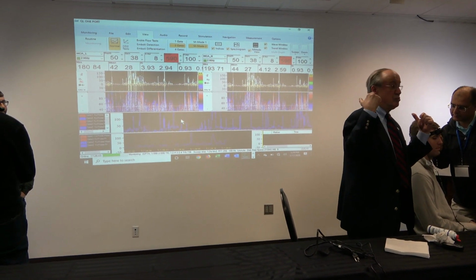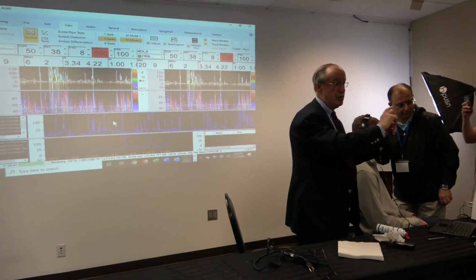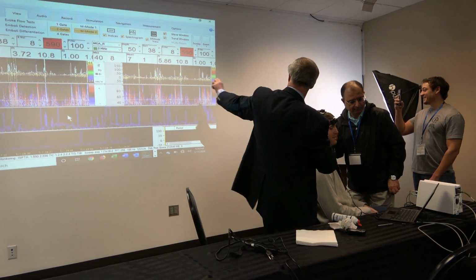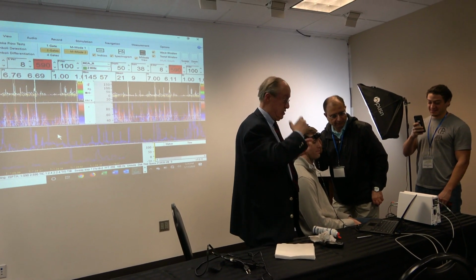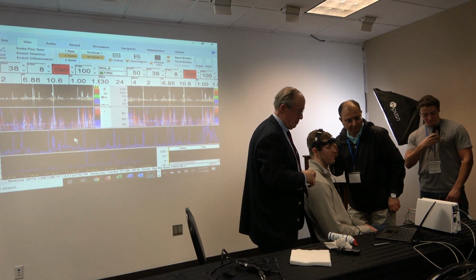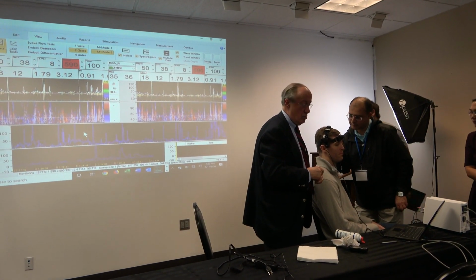We have a little bit small screens, and of course if you can monitor just one artery, we can change it, and we have just one of these screens through the whole display, which is much easier to see instead of two sides. So when you do bilateral, do you typically turn the audio off at that point, since it would be overlapping?